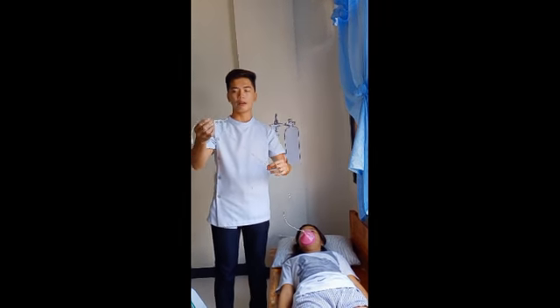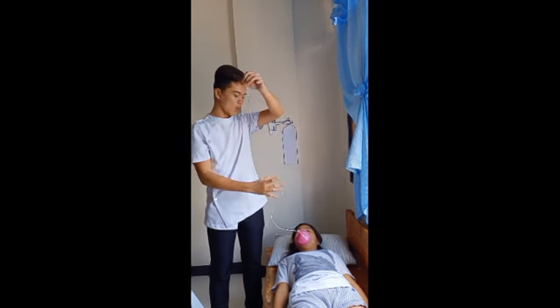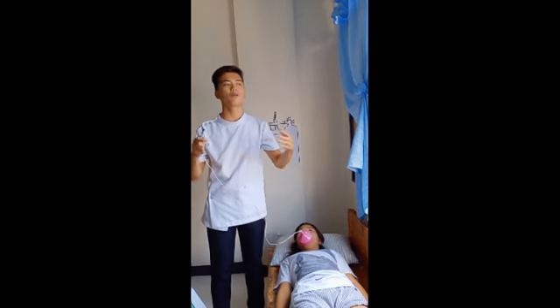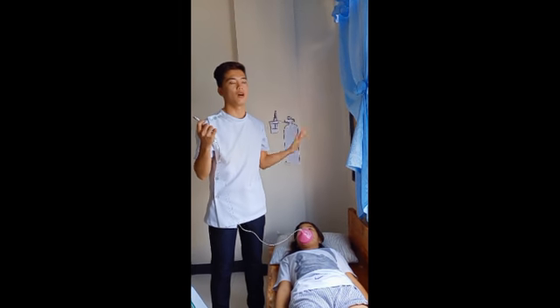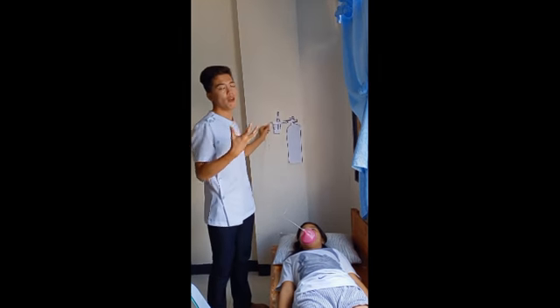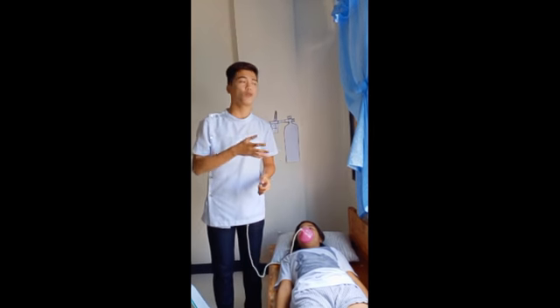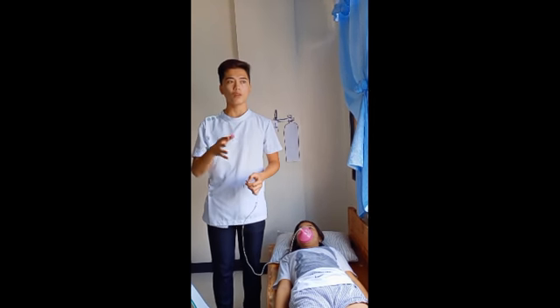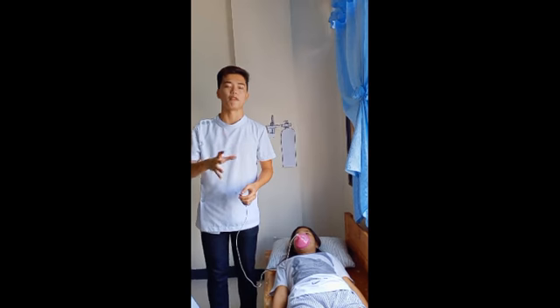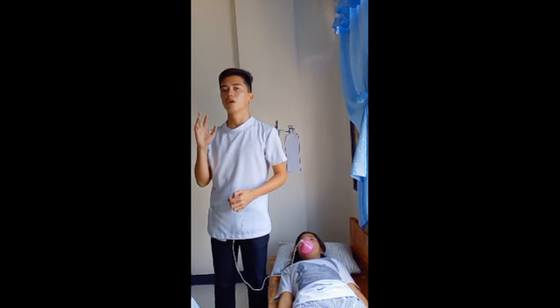By using this, the air goes through the mouth and nose of the patient, and you put this in the humidifier bottle, to help with easy breathing for the patient with difficulty breathing.